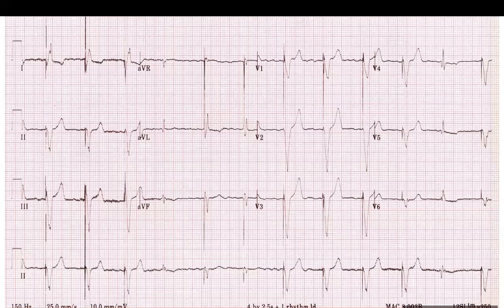Never be sure. So here, there is no indication of atrial lead activity, but it might be because of paroxysmal atrial fibrillation. So during AFib, the atrial lead is not working, but there might be an atrial lead there. It's because of something we call mode switch. I'll talk about it in a bit. For the device, it's going to behave like a single chamber device until the atria goes back into sinus.